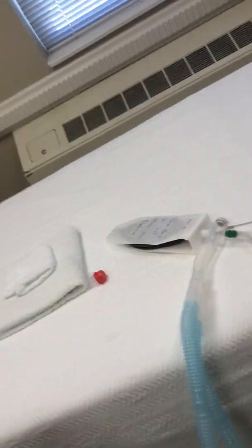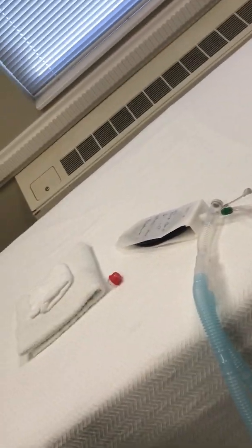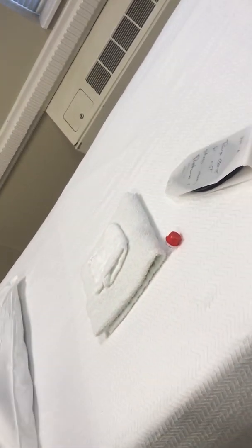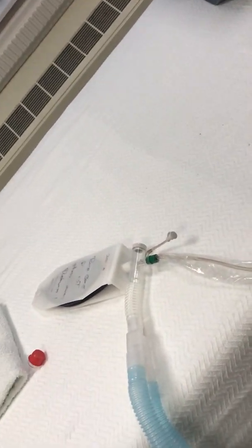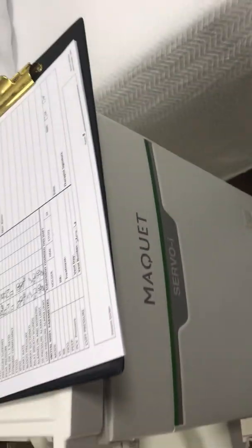Alright, so I'm going to explain a ventilator check. I'm going to introduce myself to the patient and get gloves so I can examine the patient. What I'm going to do is listen to breath sounds, suction if necessary, and check vitals. So I've done that. Now I'm going to check my vent.